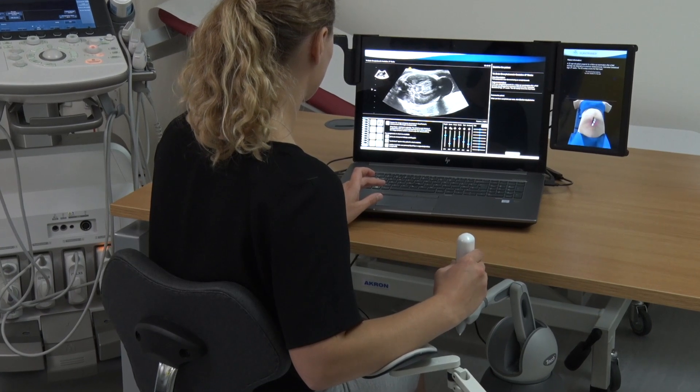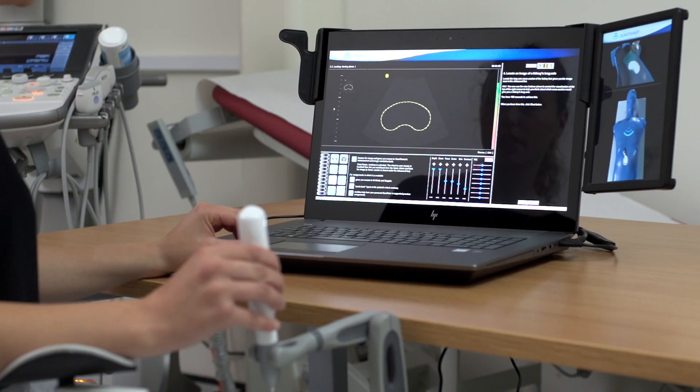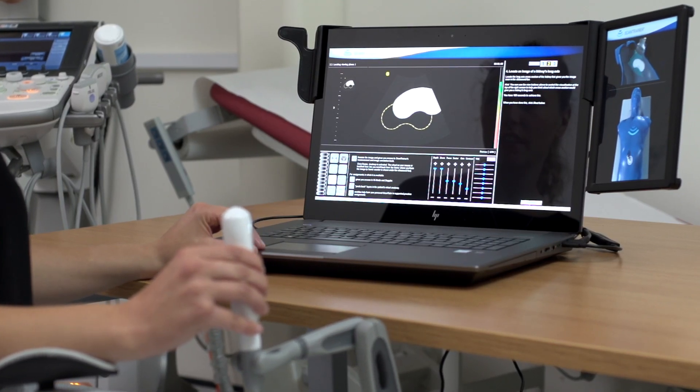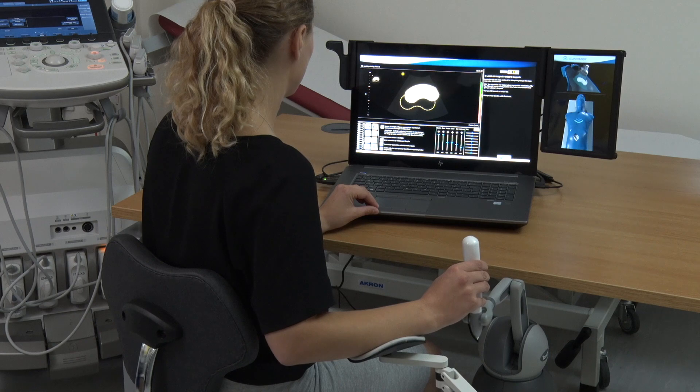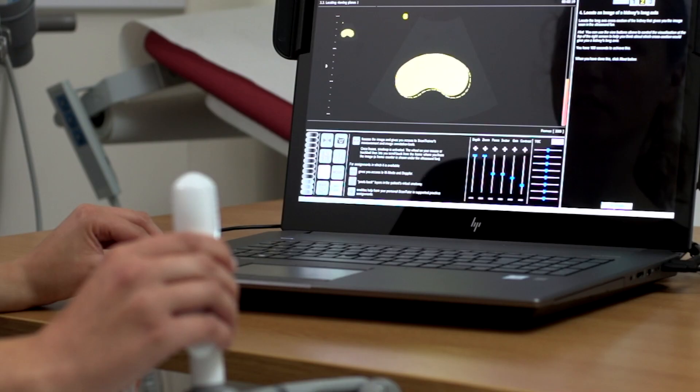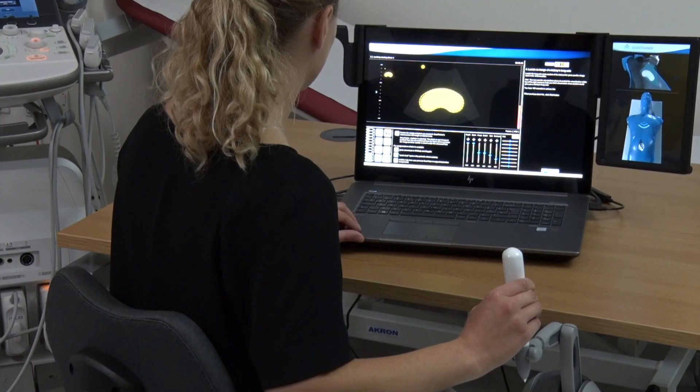Starting with our ScanTrainer Probe Manipulation module, trainees practice and perfect the subtle transducer movements required to capture quality images and examine complex structures.